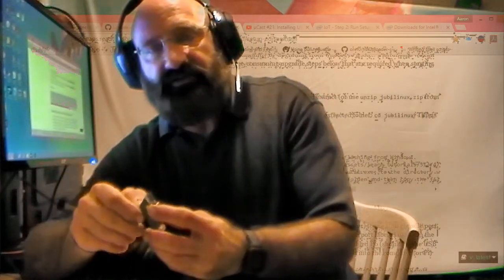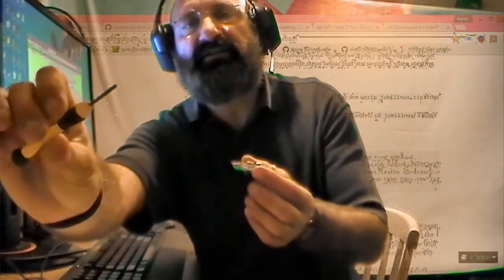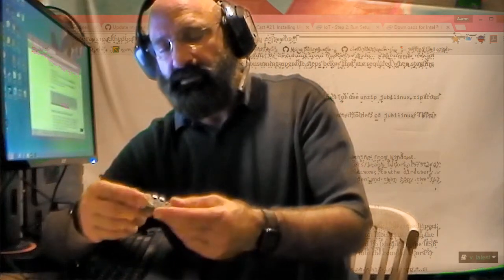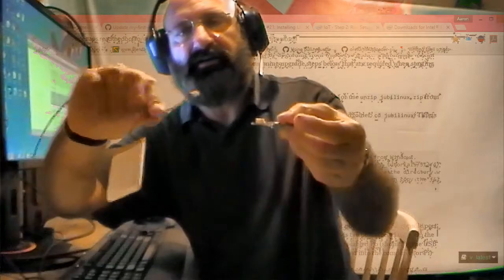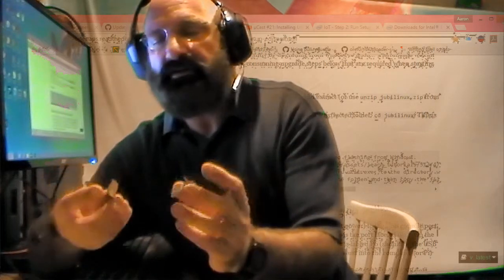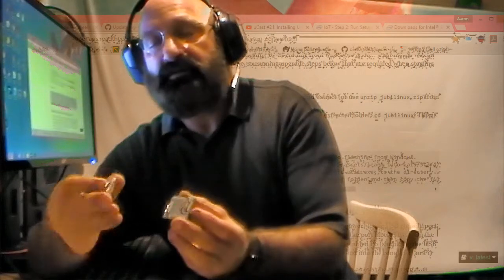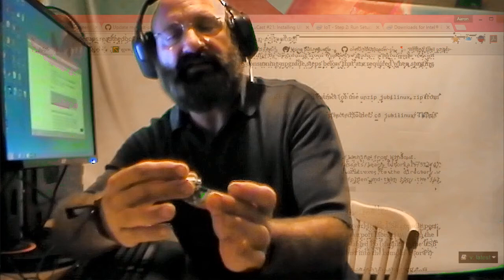Now here's my Explorer board, and I have these screws in here that came with the mini breakout board. The size of these, this is the size screwdriver you would use, and it's a number 0 Phillips screwdriver. All right. Now in this board, when we plug in the battery, it's going to go here, but you don't need a battery for this. Now I have these 2 screws already put in, so I'm not going to be demonstrating this on this video. But I can see here a black connector, and I can see here a black plug. And then I have the 2 holes in this board, and they're going to line up with these 2 holes. So don't worry about the plug yet, just line up the holes.